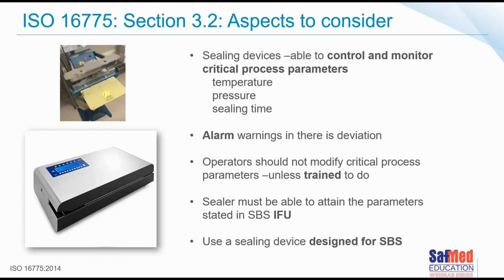Of course, it's a bit tricky if you are heat sealing a normal SteriReel type device that is going into an autoclave and you're doing a Tyvek type item. Most likely the best thing is to have 2 separate heat sealers, because otherwise you will need to adjust the temperatures the whole time, and that will be both problematic and time consuming, and plus you have to fiddle with the controls, and that has its own risks.